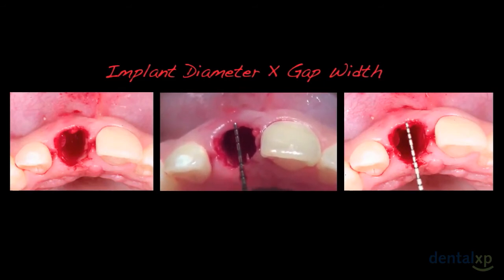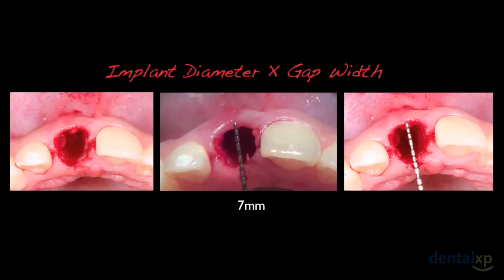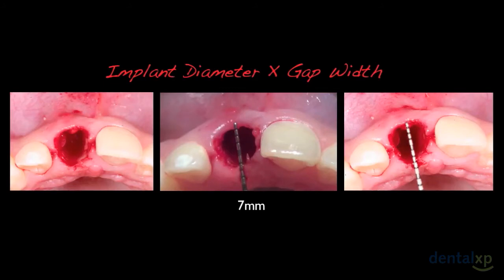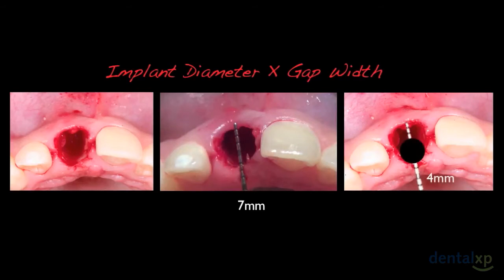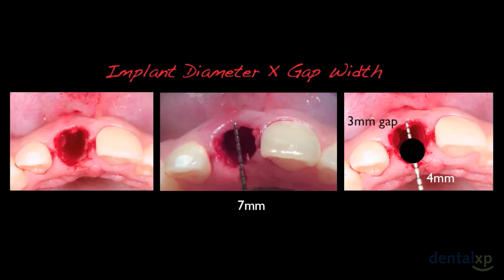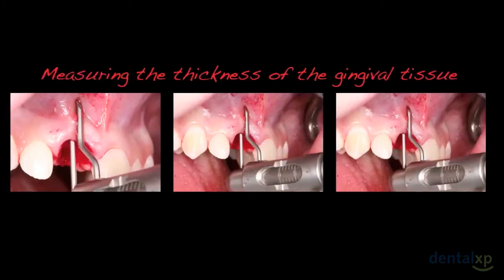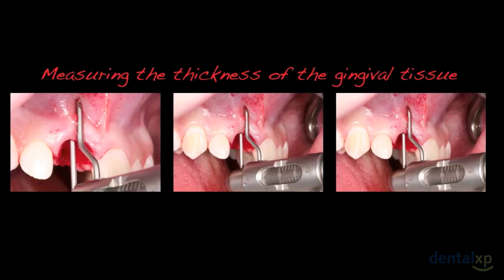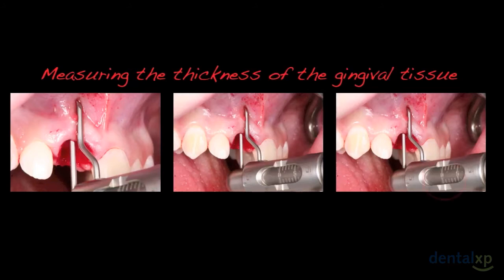After tooth removal, we can measure the diameter of the implant according to the diameter of the socket opening. Here we have 7 mm of socket opening and we expect to leave 3 mm of gap between the implant and the soft tissue. This is why we will select a regular platform implant for this case. At this time, we can also measure the thickness of the gingival tissue to compare it to a new measurement at 3 months — here we can see around half a millimeter thick.